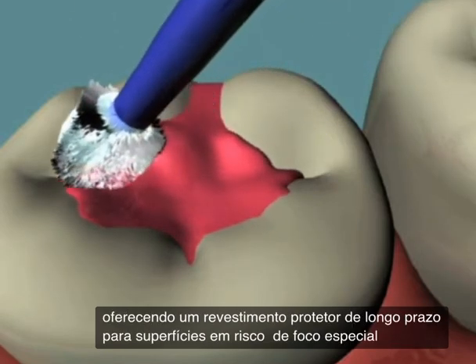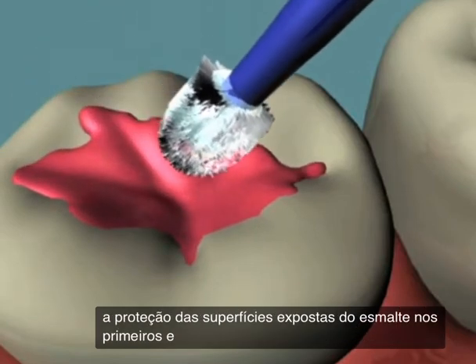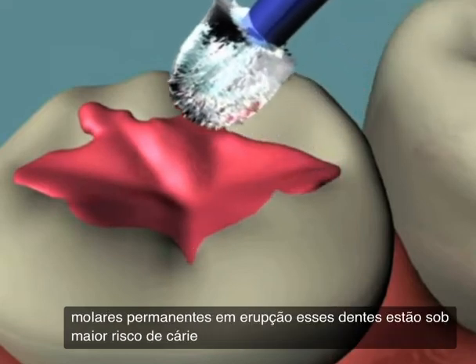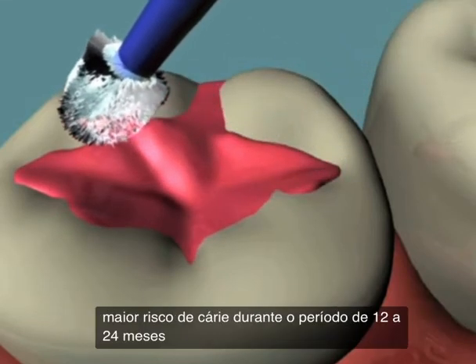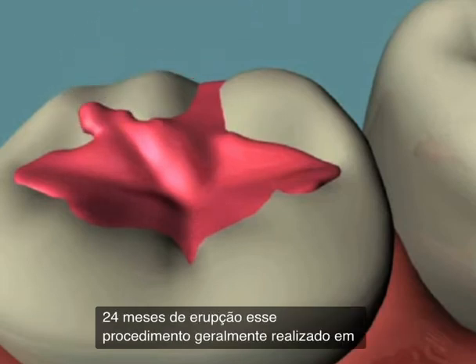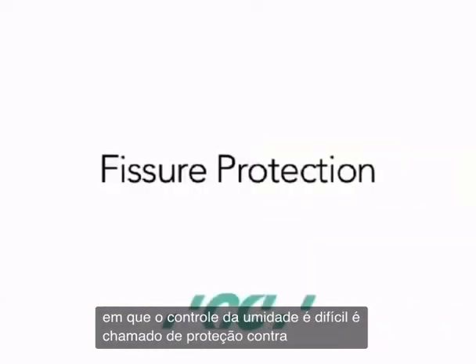Of special focus is the protection of exposed enamel surfaces on erupting first and second permanent molars. These teeth are at their highest risk of caries during the 12 to 24-month period of eruption. This procedure, often undertaken in situations where moisture control is difficult, is called fissure protection.